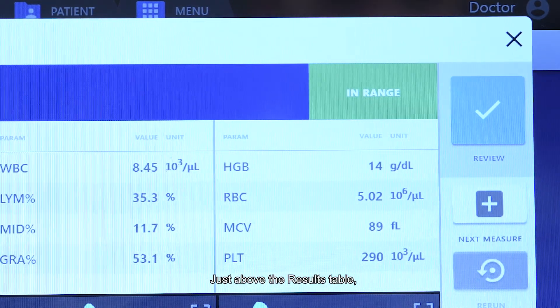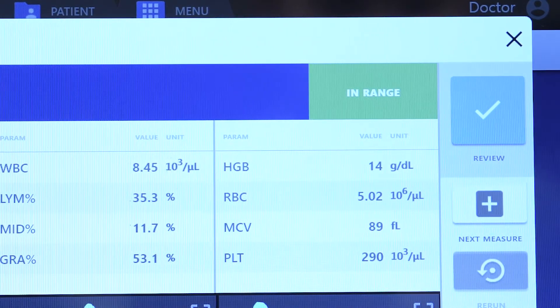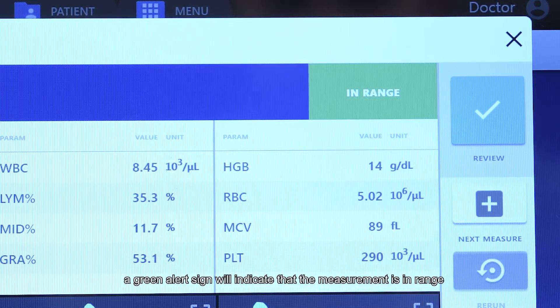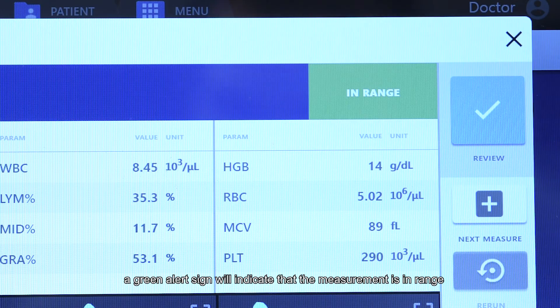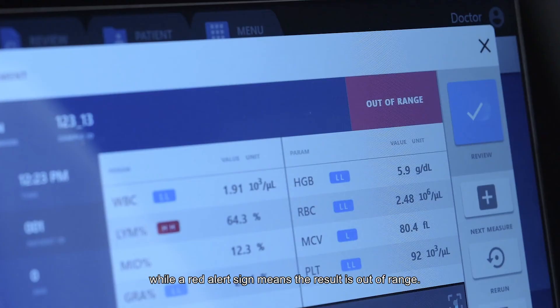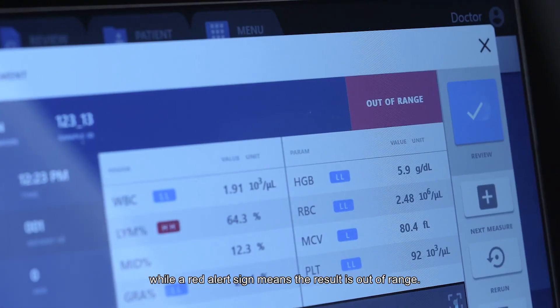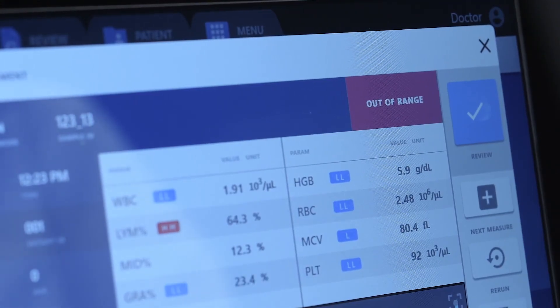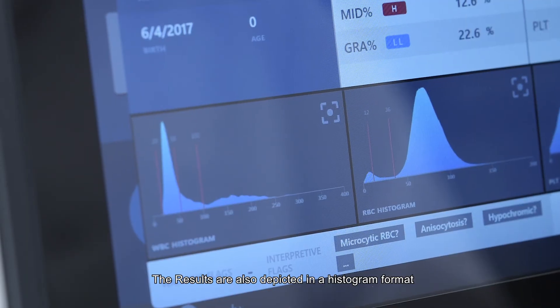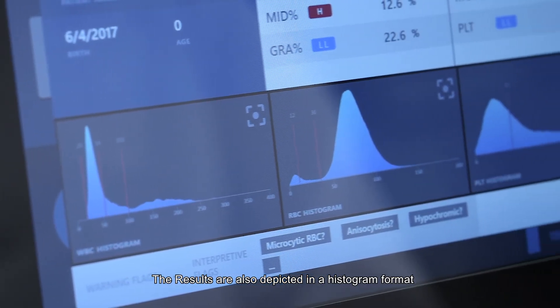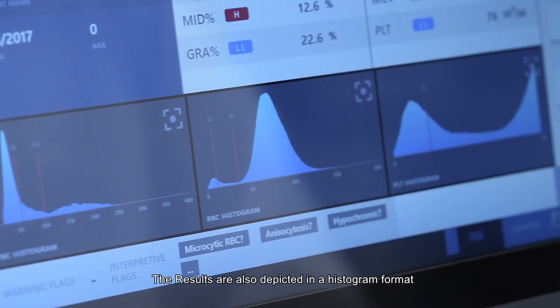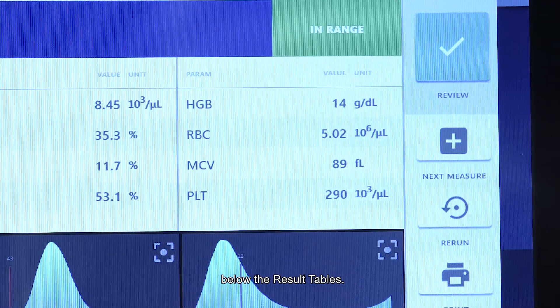Just above the results table, a green alert sign will indicate that the measurement is in range, while a red alert sign means the result is out of range. The results are also depicted in histogram format below the result tables.